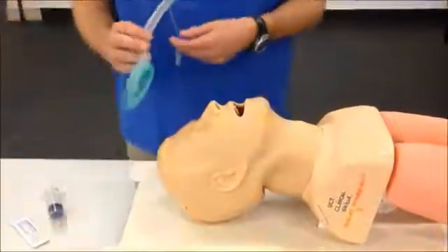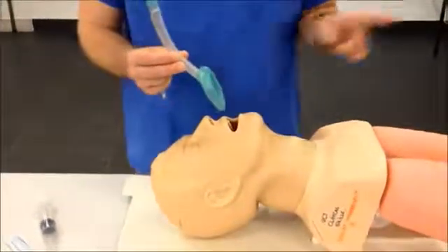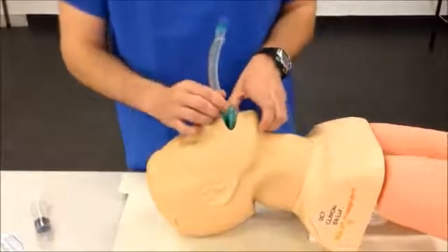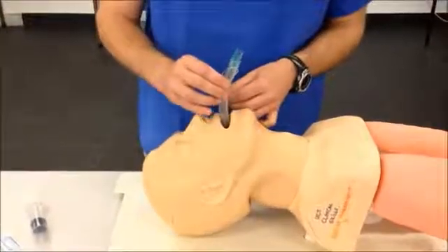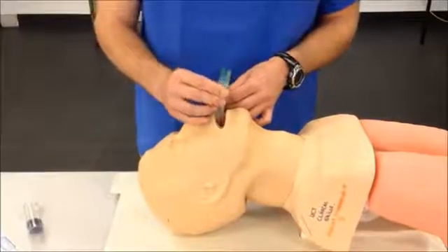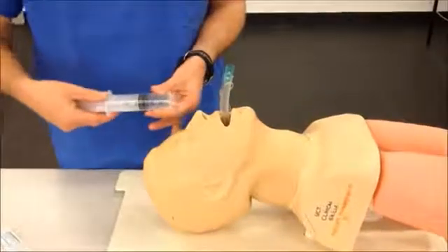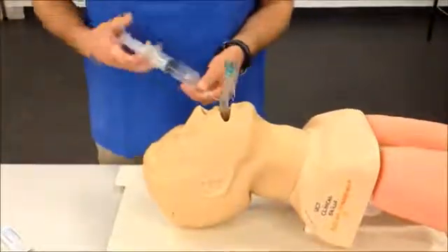To insert the LMA into the patient, make sure the airway part of the LMA points towards the lungs or feet of the patient, and then gently insert into the mouth. It may be necessary to open the jaw slightly. Then, with firm but controlled pressure, slide the LMA until you feel it seating in the pharynx and the supraglottic area of the patient. At this point, we would select the amount of air, 30 milliliters as indicated on the tube, and inflate the LMA cuff.